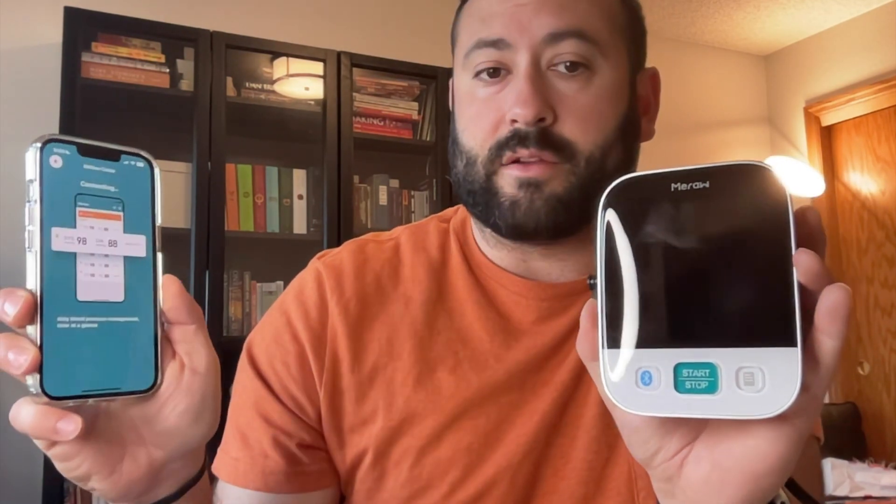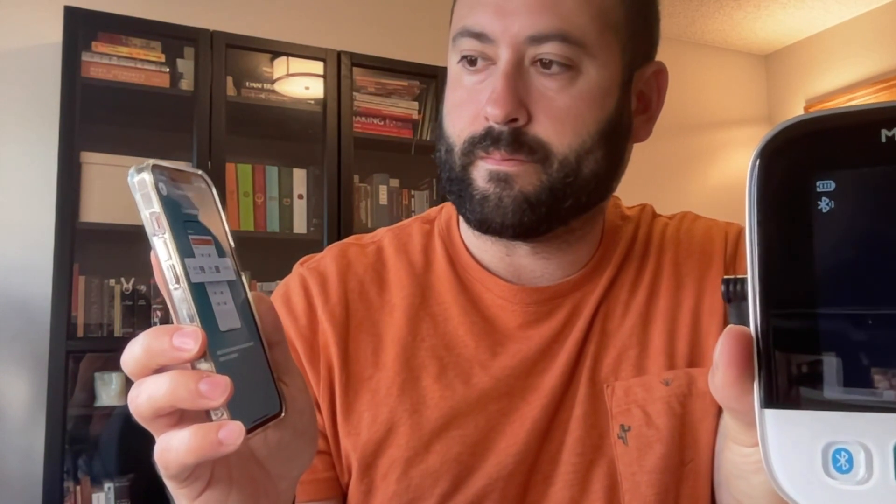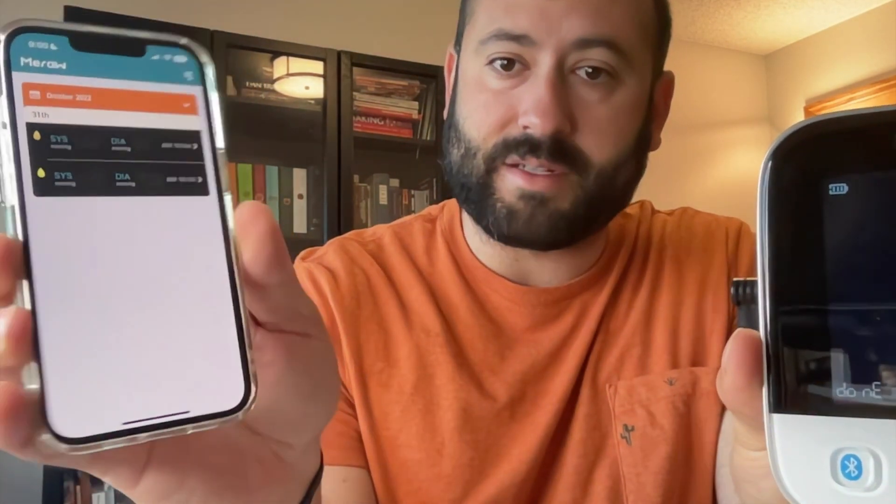It's connecting right now. We'll get that flashing icon right there. And it says success — that's how you know it's set up.